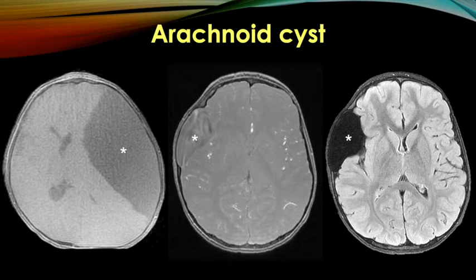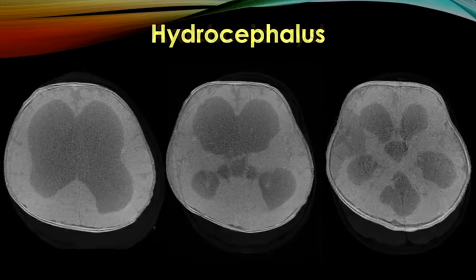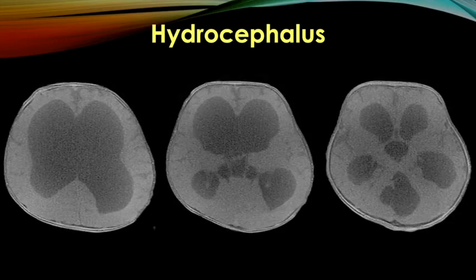So ZTE can be helpful either as part of a full MRI or a rapid MRI exam to assess the degree of mass effect on the underlying parenchyma, as well as looking at the deformity of the cranium and making sure that there are no other bony abnormalities prior to any surgical intervention. Many practices will perform both preoperative MRI and CT prior to operative intervention, the CT primarily for bone delineation.